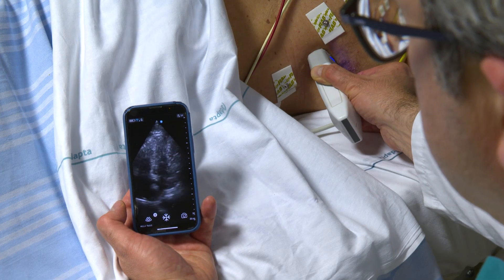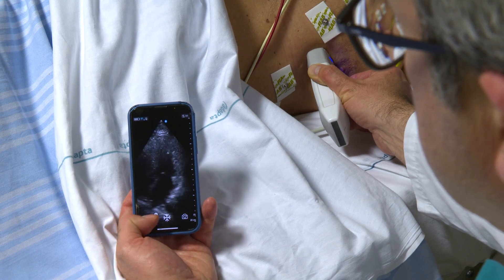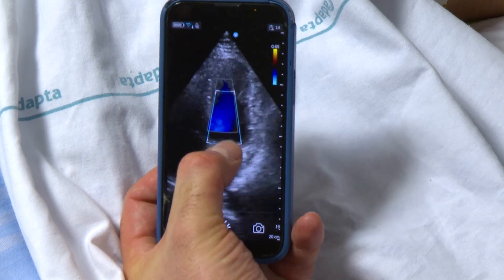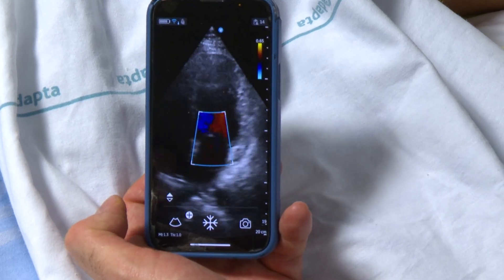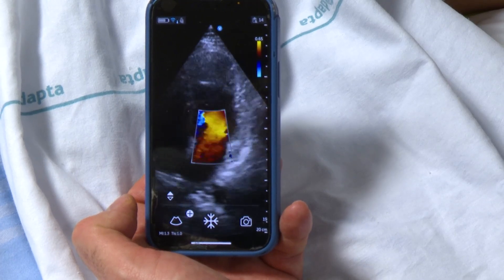It's really a universal tool that can easily improve every single step in the assessment and treatment of the patient. The quality is very high. It seems really built for the cardiology workflow because you have the echocardiographic probe, which allows you to assess ventricular function. There is also color and Doppler — you can assess the valves. You can build a picture of the patient before bringing them to the cath lab.